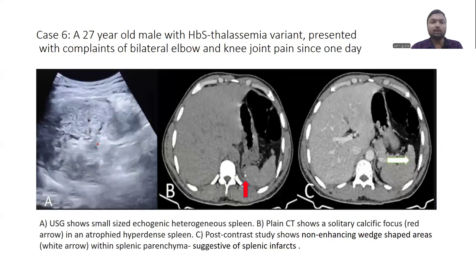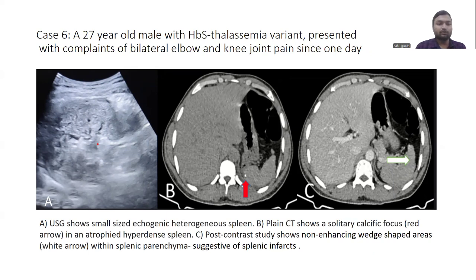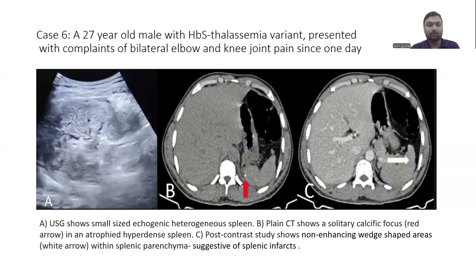Case 6: a 27-year-old male with the HbS-thalassemia variant presented with bilateral elbow and knee joint pain. Ultrasound showed a small-sized echogenic heterogeneous spleen. On plain CT, there was a solitary calcific focus in an atrophied hyperdense spleen. On post-contrast, there were non-enhancing wedge-shaped areas within the splenic parenchyma, suggesting splenic infarcts.